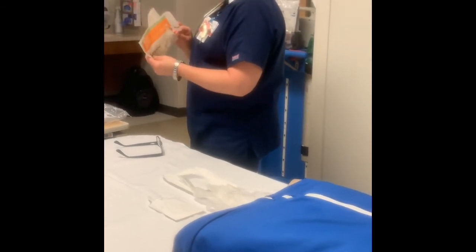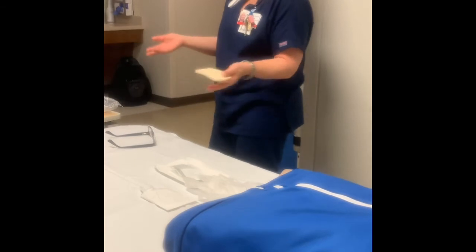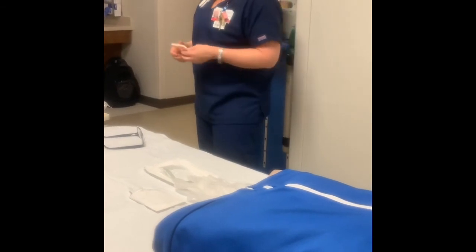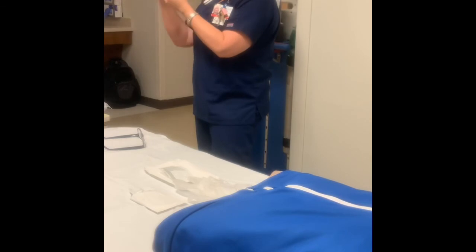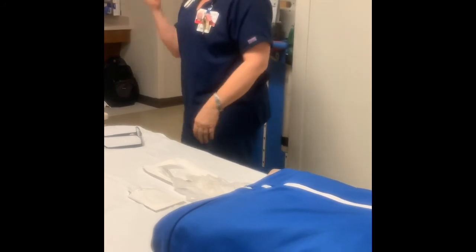I got called over to the infusion center once by clinical nutrition. They said, Lord, we've got this PEG tube that's draining everywhere. And I'm like, well, maybe the balloon's not inflated. It needs to be. She says, no, it's inflated. So I popped over, it was all excoriated. It was looking pretty bad. We cleaned it and put this underneath, and it provided a bolster. It pulled the tube out a little bit more and also helped with the excoriation, and it stopped leaking. These things are amazing.